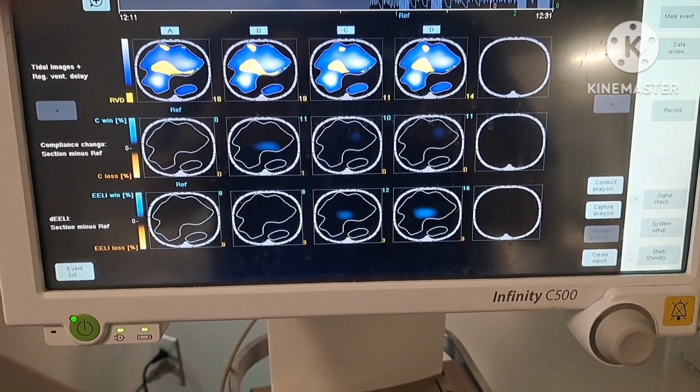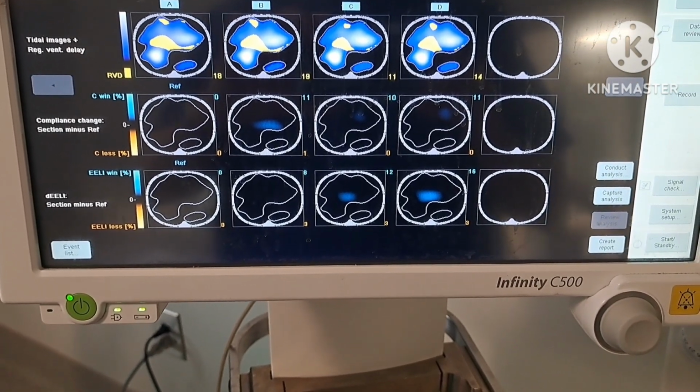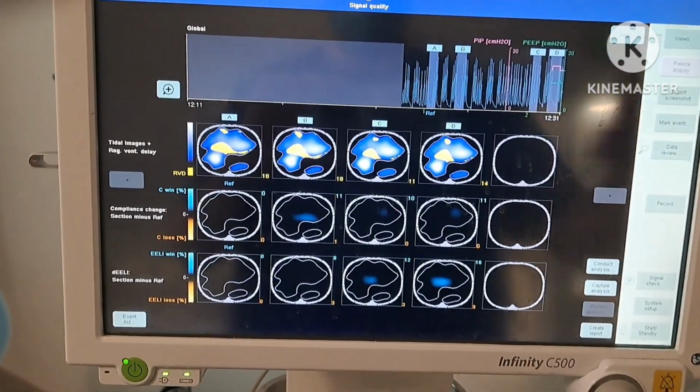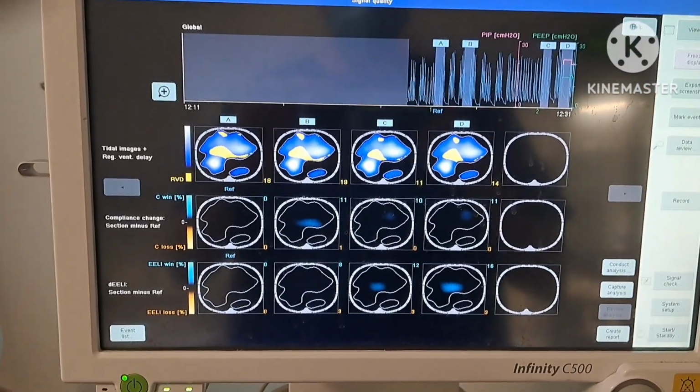We're going to go up to 16, one more, and see if that's a change. And then we'll just do a trial of APRV to see if pressure and time with a higher T-high, exerting a certain pressure but for longer periods of time, will do the trick.